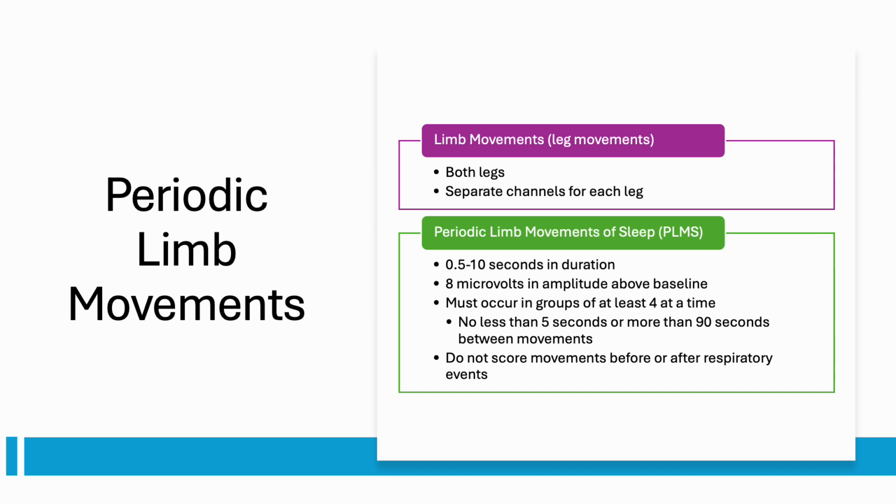so if one moves more than another, that one may require further investigation. Also, if there is not a place in the report to show how much the patient had hypnagogic foot tremor or bruxism or something else, then there is probably not a way to score it. Or it's not something the provider thinks needs to be listed in the report. Anything that's not listed in the report can still be added through the provider's analysis and recommendations.